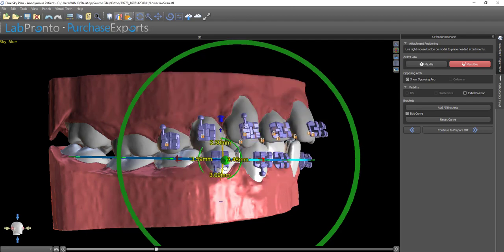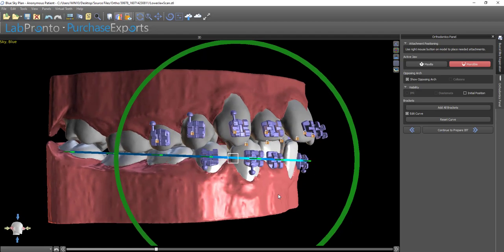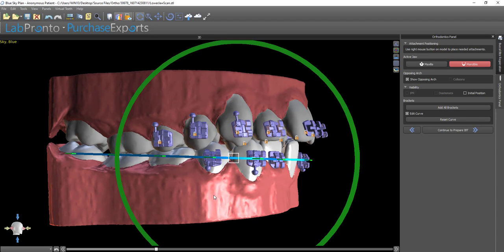Once again, we right-click and choose Snap to Tooth for each bracket. Once we've finished the process of aligning all the brackets to the center of the teeth, we click Continue to Prepare IBT.